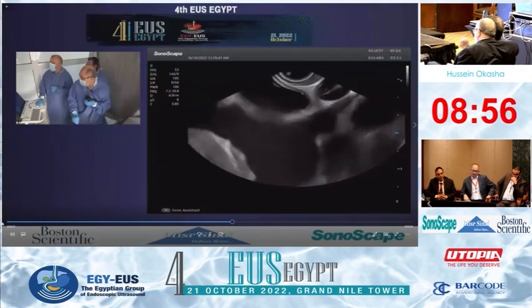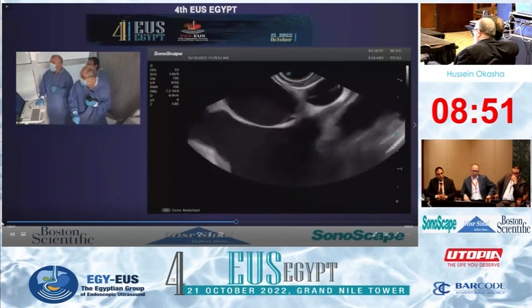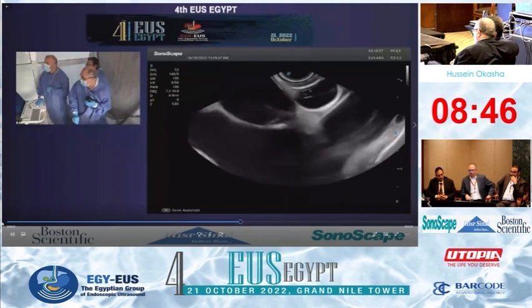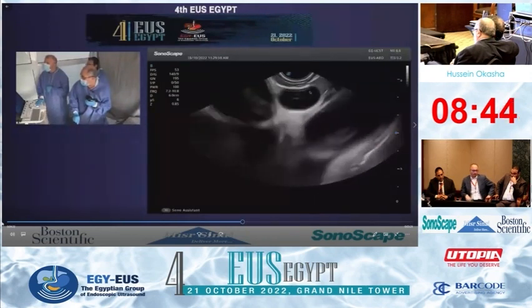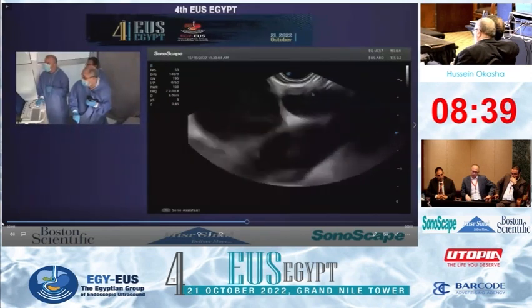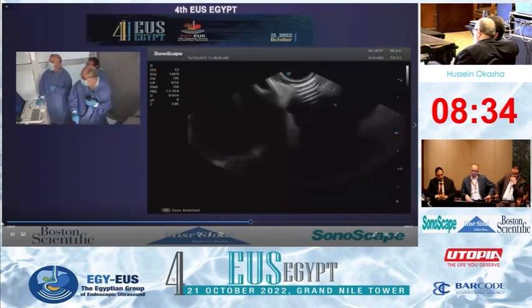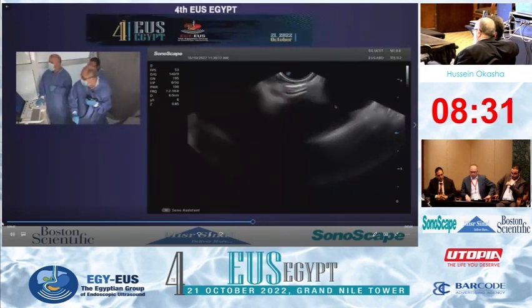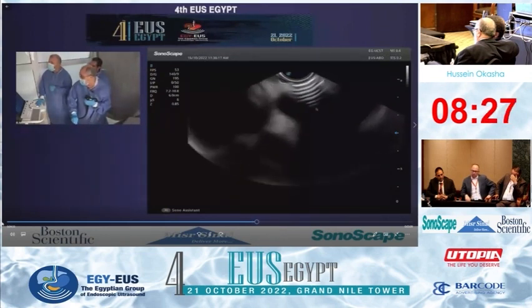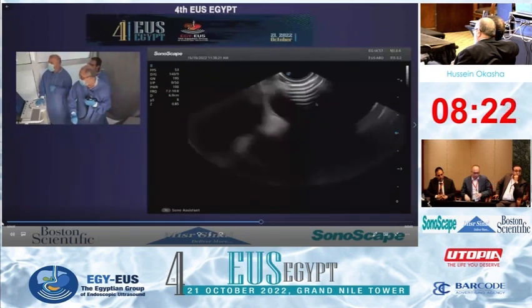Then I'd like to see the aortopulmonary window. To see the aortopulmonary window from the subcarinal area, I do 3 movements. Withdrawal of the echo endoscope is the first, and then anti-clockwise rotation and upward deflection. So I can see here very nicely the trachea with the air shadow inside. This is the trachea, and this is the Mickey Mouse appearance or aortopulmonary window.